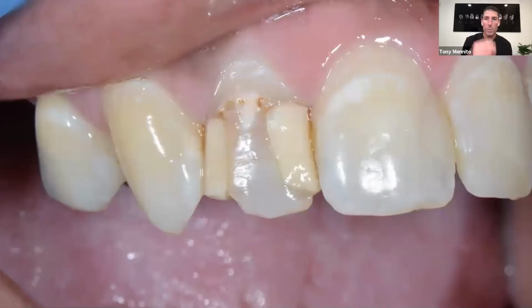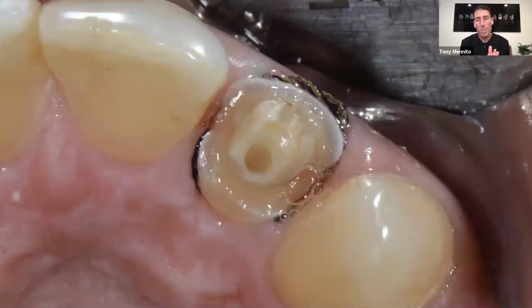So here's a case that we did quite a few years ago, actually, with Empress. This is a patient who came in with some of the worst composites that I've ever seen done on a human being. These are truly horrible. But we figured at this point we could do no wrong, because you're only going to improve this situation, right? For Empress, because we need a certain amount of thickness, and because the patient was partially edentulous in the posterior, we wanted to give ourselves plenty of ceramic thickness for this preparation. You can see it's a pretty aggressive prep.